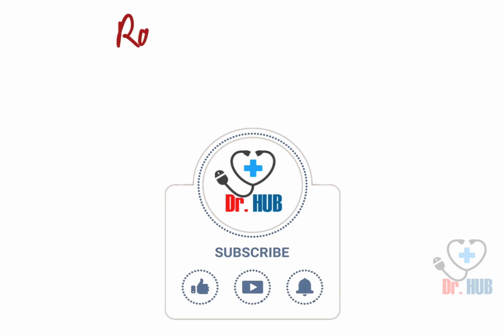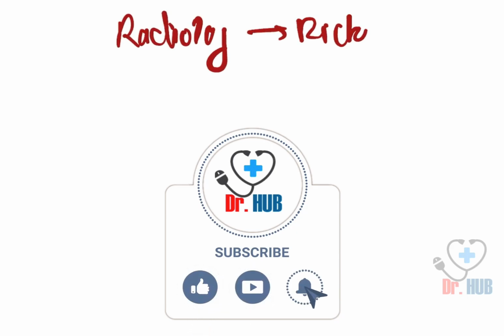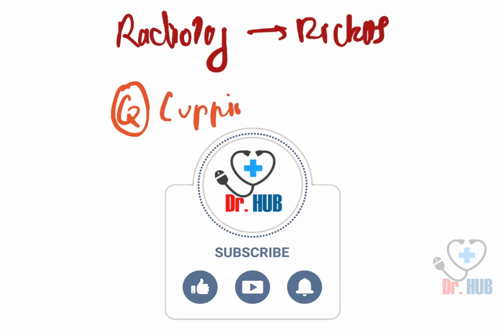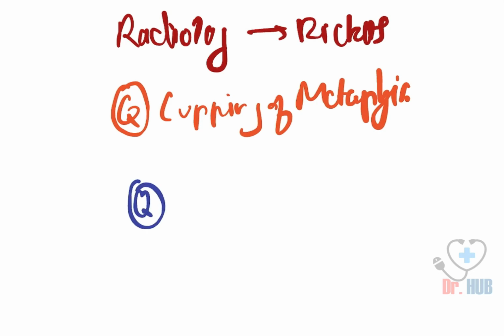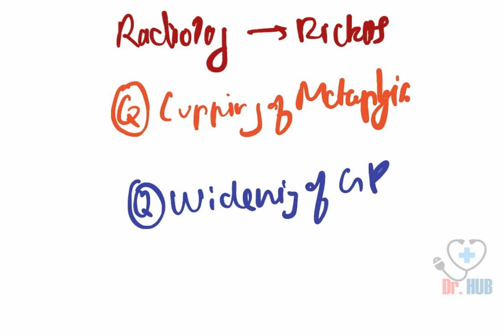In this video, we will look at the radiological features of rickets. To start off with a few questions, the first question is, what is known as the cupping of metaphysis? What exactly happens in the cupping of metaphysis? Second one is, in widening of the growth plate, what is happening? Why does the growth plate widen?